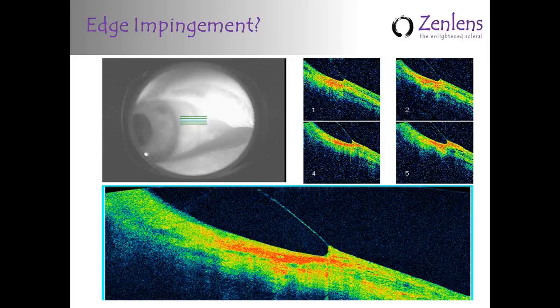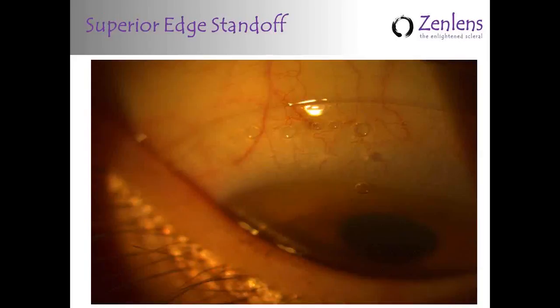If you're looking at a lens, sometimes the practitioners will say, it looked okay, it might have been a little steep, a little tight, or a little flat. That's the scenario where I think you're safe if you just make a one-step adjustment, 30 microns, maybe ease your mind a little from what you were seeing. And a 30 micron adjustment is certainly safe. I think patients aren't likely going to notice a difference in how the lens feels. And of course, patient comfort is another means of evaluating.